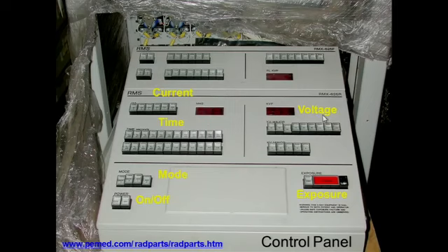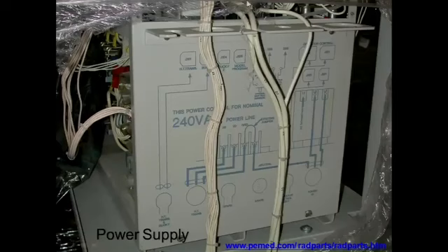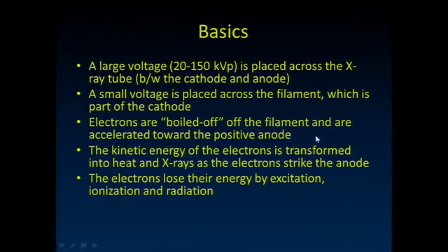This has been replaced with computerized units that select these things automatically. But back in the old days, you set your voltage by picking a button here, and your current here, and your time here. A similar thing is happening now. It's just more under computer control rather than human control. And you can see how large one of these generators is to power these X-ray units.